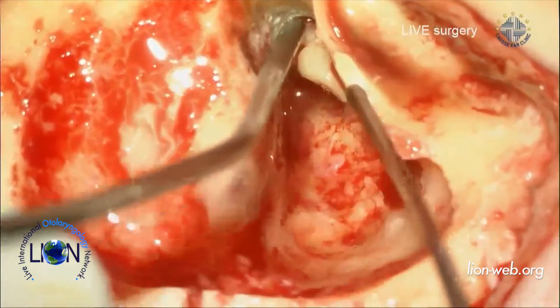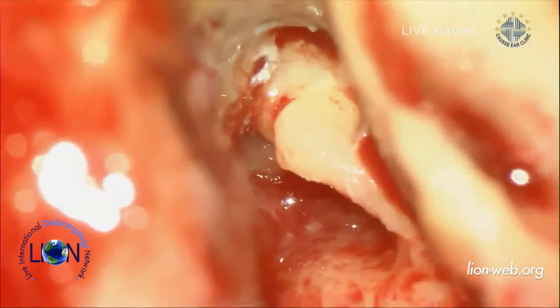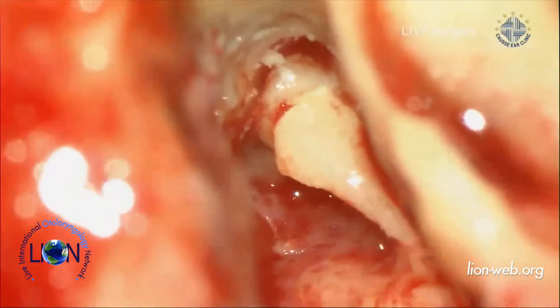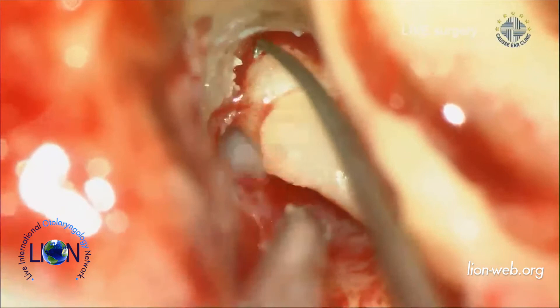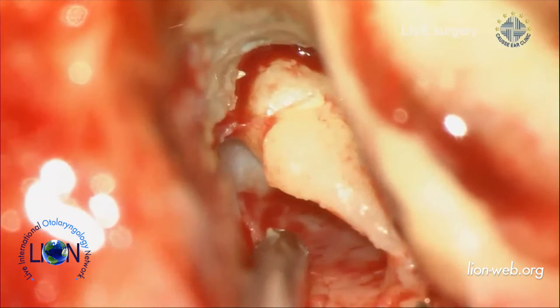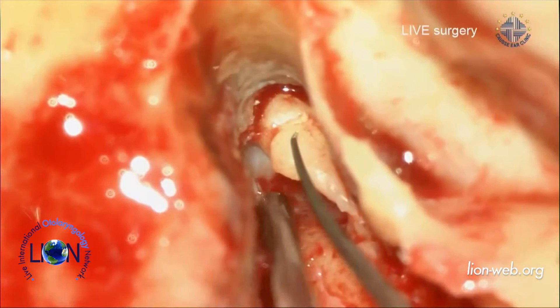As you can see, there is not a lot of space and there is still some tympanosclerosis in the attic. From the audience: Do you not think you are likely to get recurrence of the tympanosclerosis and that the fixation will return? It is possible. What proportion will it decrease the efficiency of the Soundbridge? I cannot say for the moment. If it happens, I can revise and put the Soundbridge on the stapes, for instance.